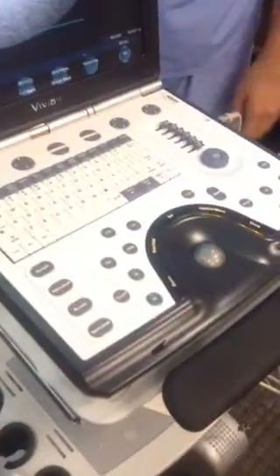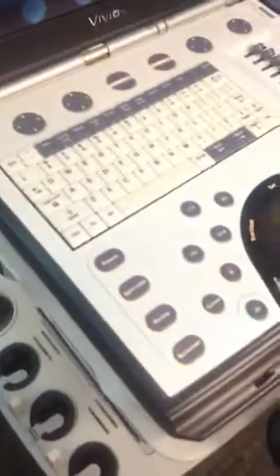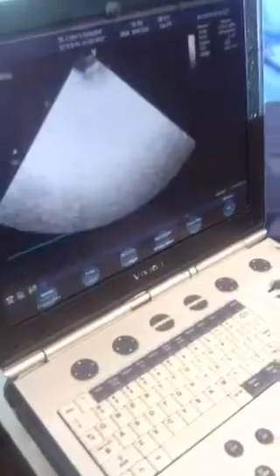All right, so you've done your exam. You're ready to end your exam. That's the next thing we want to be sure we know how to do. You go back up to the patient button where you started. Somebody wants to hit patient, and you hit end exam. And then set. It's asking us, do we want to save all of our images? Yes, we do. So go ahead and set that, and it's just going to archive them all onto the hard drive of this machine.